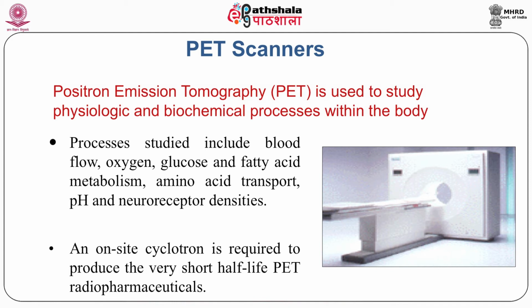So what we can say is that PET is used to study physiological and biochemical function within the body. Processes studied include blood flow, oxygen, glucose and fatty acid metabolism, amino acid transport, pH and neuroreceptor densities.